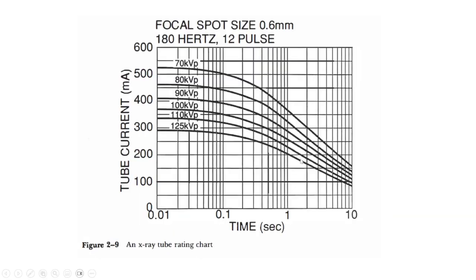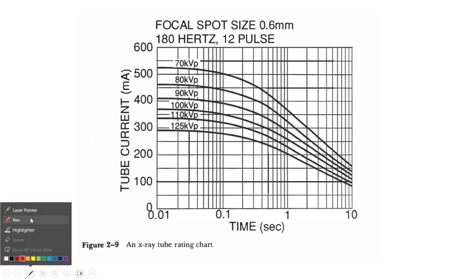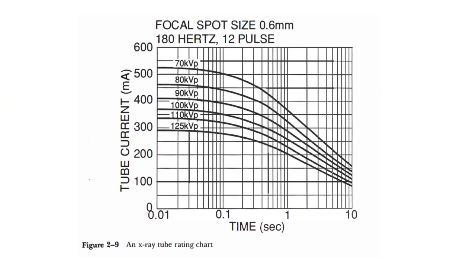Hello friends, let us now learn some important points about tube rating charts. So this is a tube rating chart. Actually, if you see, the load for an X-ray tube is mainly measured as kilovoltage peak, milliamperes and exposure time.